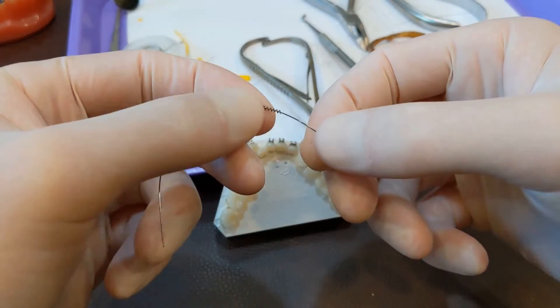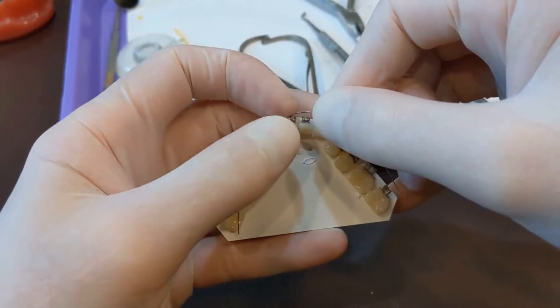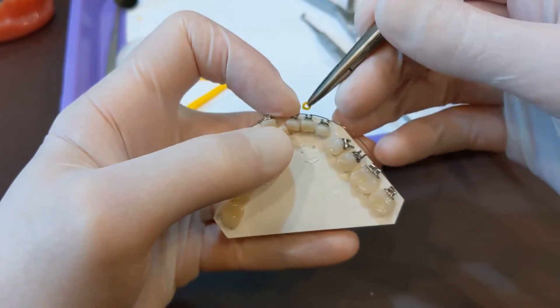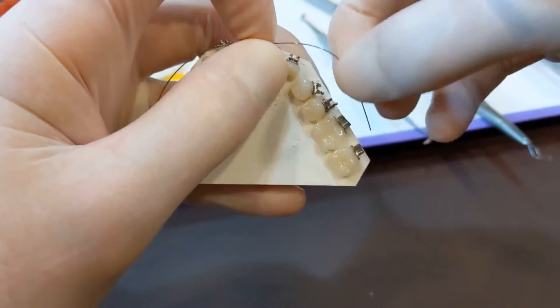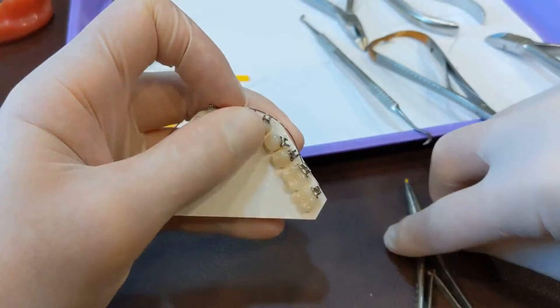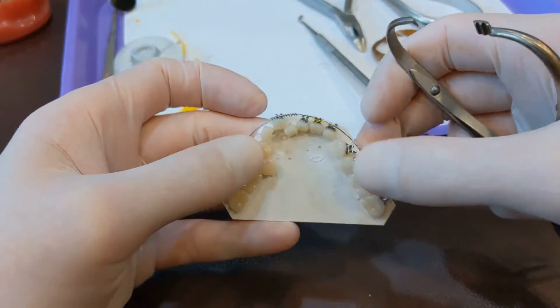To put the open coil spring in place, slide the spring onto the wire outside the patient's mouth. Then get the midline — the little line on the wire — and line that up with the midline on the arch, then put the spring where it should be. I usually like to hold the wire in place with an O-tie first. Put it on one of the brackets that's not adjacent to the space, then put the wire through the six and the seven, and hold it in place with an O-tie.